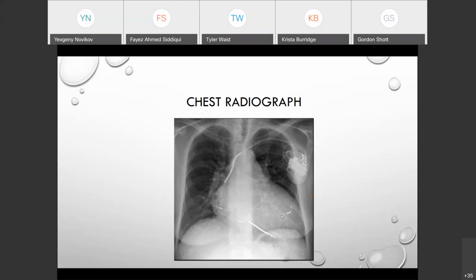And then when we're doing biventricular pacing, which we'll briefly mention later, what we do is we feed another pacing lead through the coronary sinus, and it weaves back here behind the LV, and you can actually pace from the coronary sinus. We'll talk a little more about bi-V pacing later in the talk. Any questions so far about that?